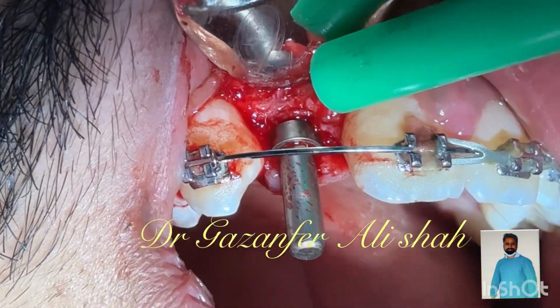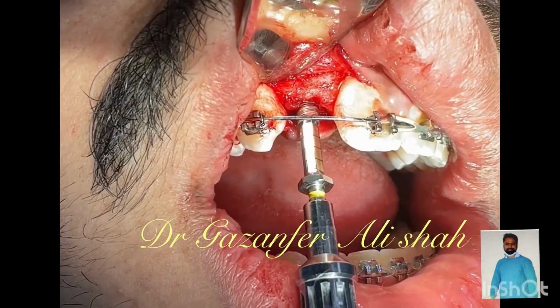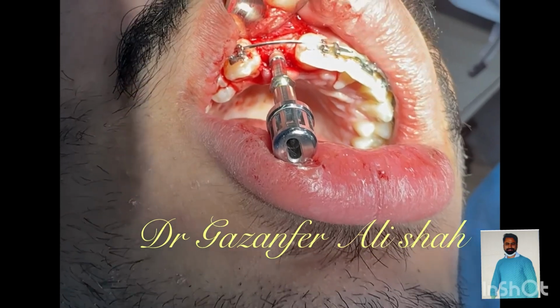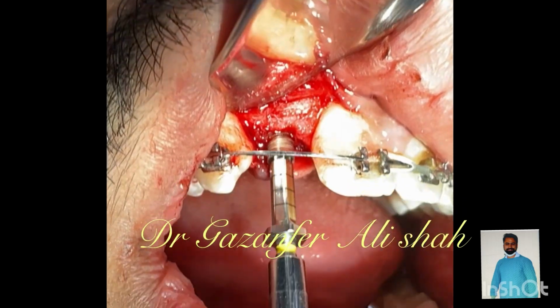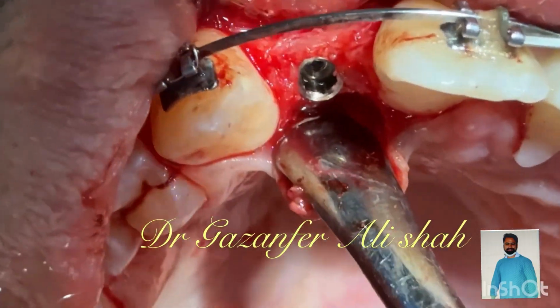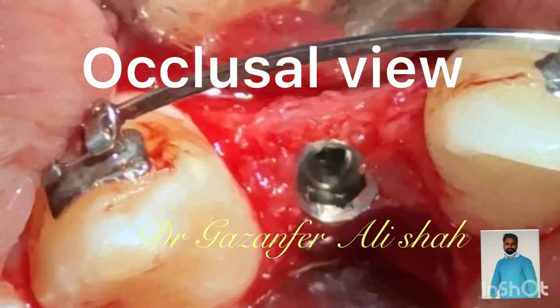To check its angulation with the adjacent roots, we use a guide pin and take an IOPAR to check the angulation. After that, we are using sequential drills, 2 mm and 2.8 mm. Our final drill should be 0.5 mm deficient from the implant fixture to achieve primary stability.